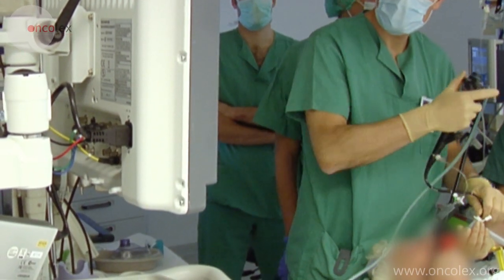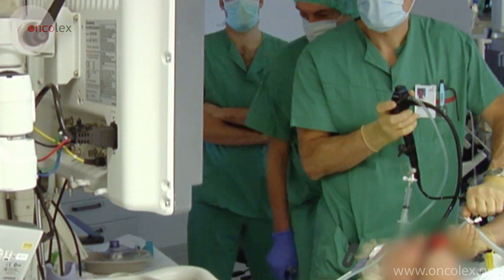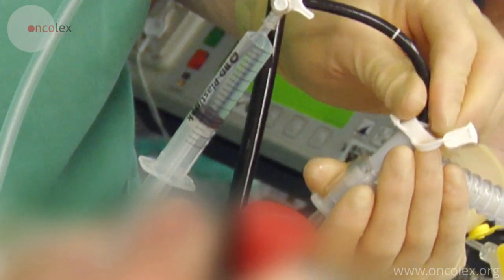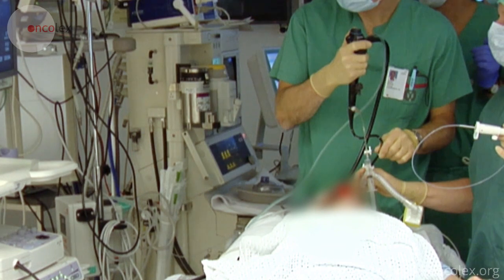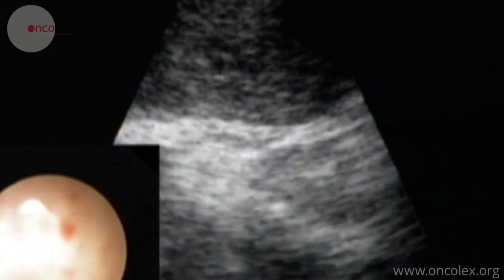The ultrasound bronchoscope is inserted down into the bronchi. The scope has both a camera and an ultrasound head. The lymph node is located using ultrasound and the scope is placed in the best position for the biopsy.